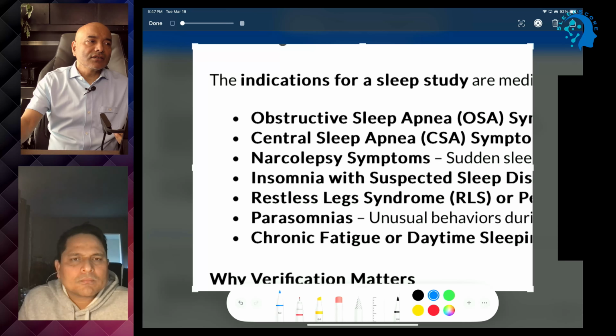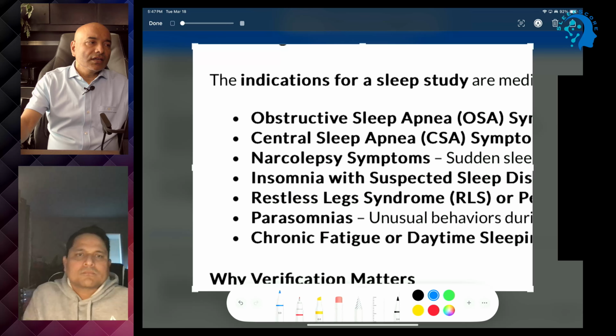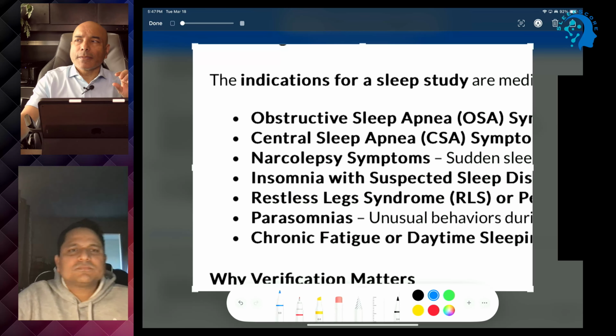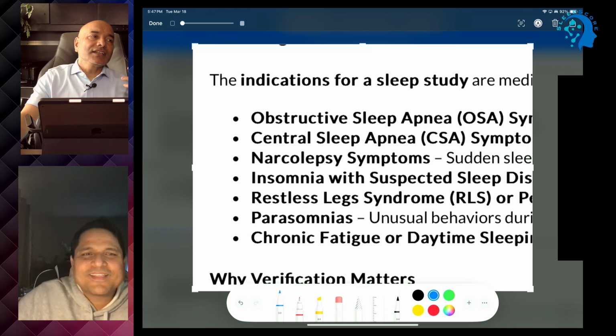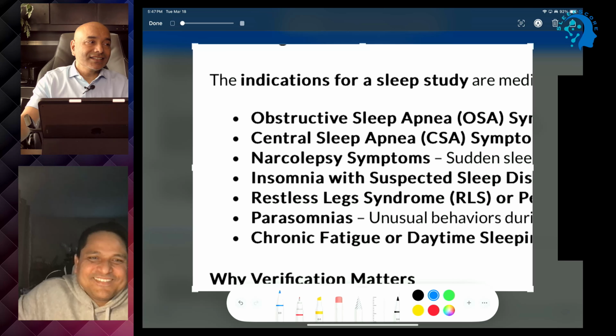That's narcolepsy. In narcolepsy, maybe I can show you another video. To do the narcolepsy test, we do the MSLT test. Did you understand a little bit about narcolepsy? It can really happen, a person actually with a history of narcolepsy, captured on videotape. Let's take a look at that.